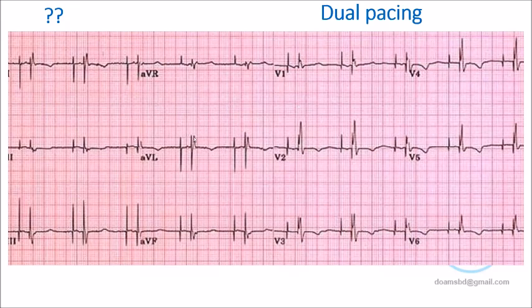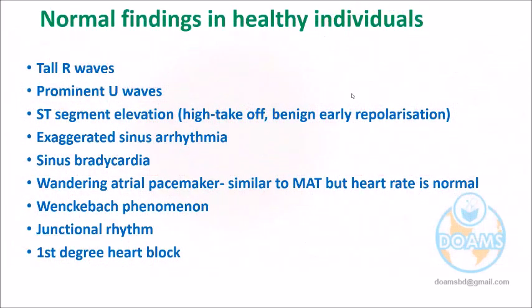Today you are talking less because ECG may be harder for you. As much as possible from my side, we tried our best. This is the normal finding in a healthy individual. Make a snapshot, doctor, I will not read. These are the ECG findings when the patient does not have any cardiac disease.